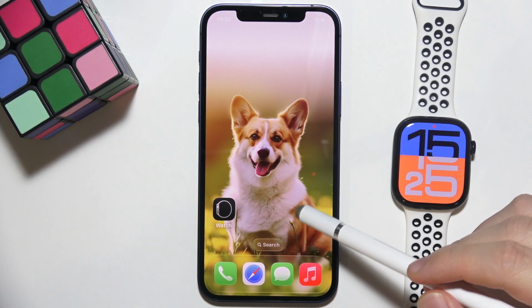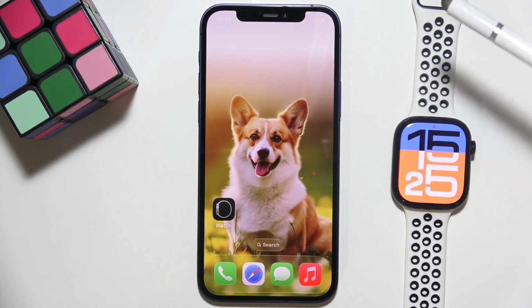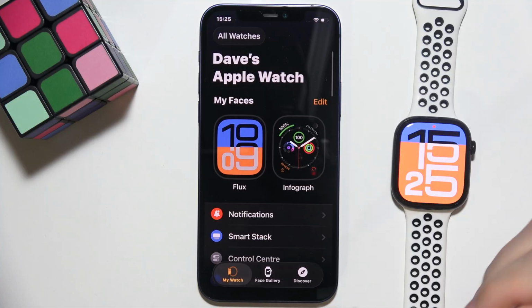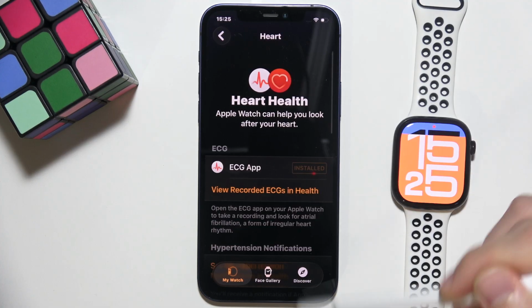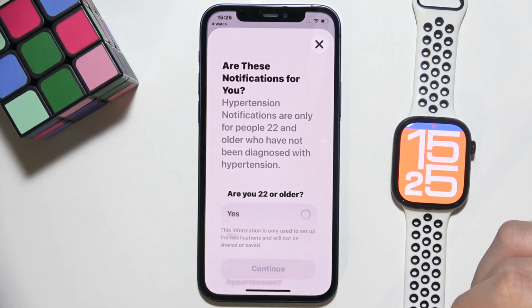If you want to set up hypertension notifications on your Apple Watch, you have to start by opening the Watch application on your iPhone, go to My Watch in the bottom left corner and select Notifications. Next, you will have to scroll down and navigate to the Heart application. Then go to Hypertension Notifications and simply click on it.